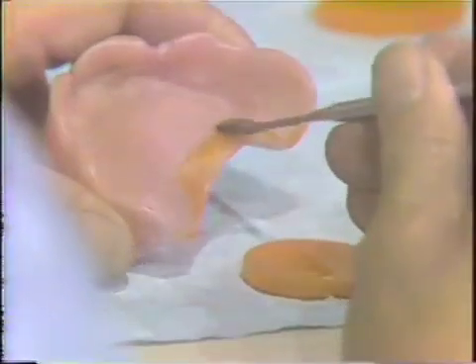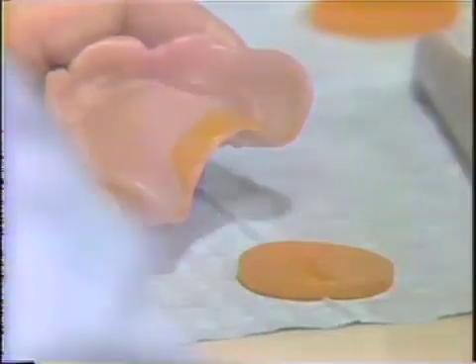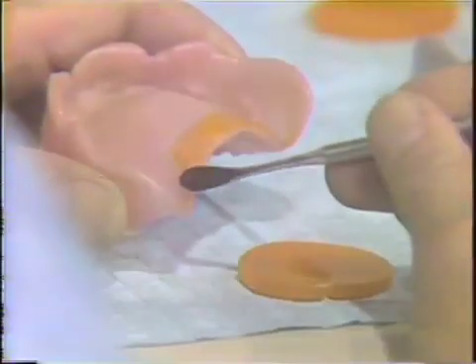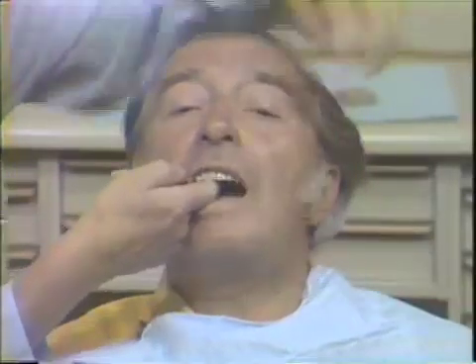Apply number four correcto wax to the posterior border of the maxillary denture. Then, reposition the maxillary denture in the mouth of the patient and have it hold moderate pressure for about five minutes.